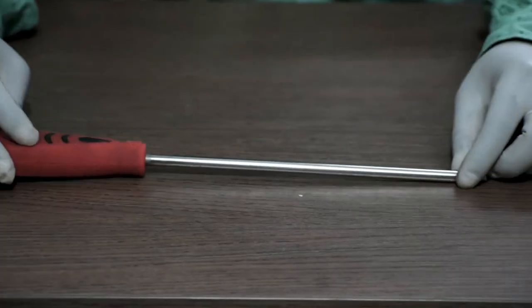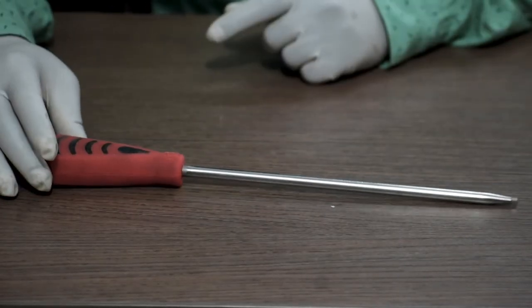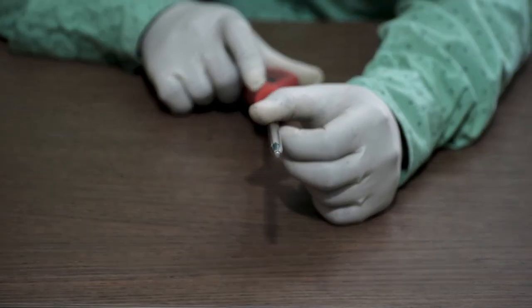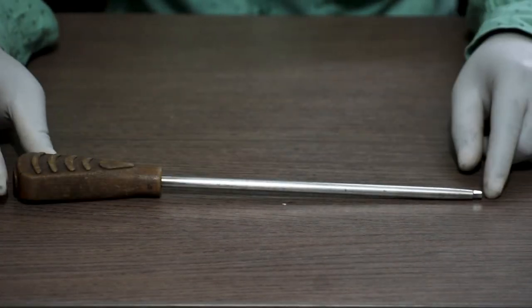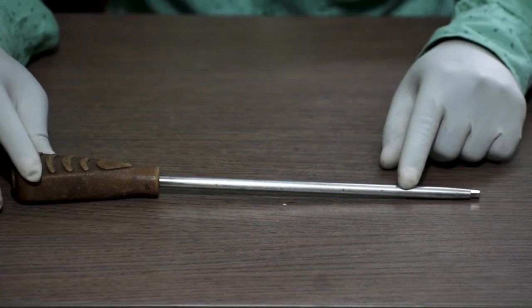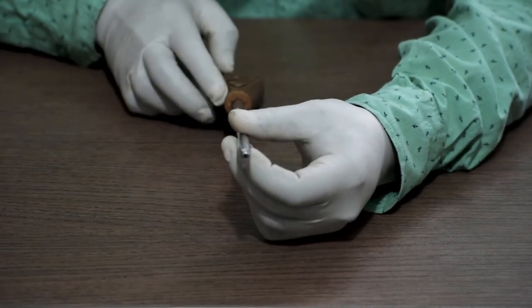Now let us talk about screwdrivers. This one is 4.5 mm distal locking screwdriver. This one is a solid screwdriver of 250 mm length. This one is a 5 mm locking screwdriver. This one is a 250 mm length screwdriver and this is cannulated.